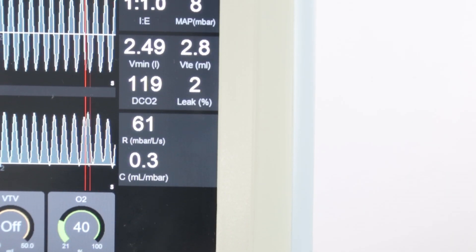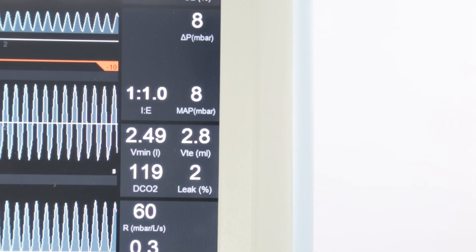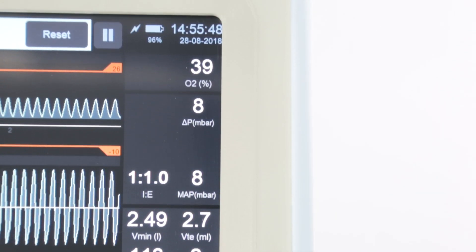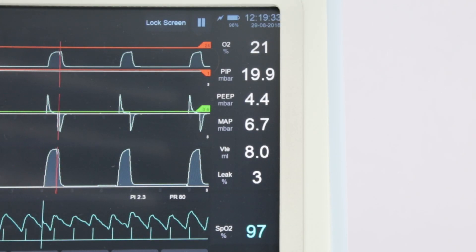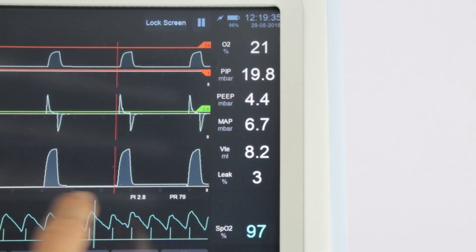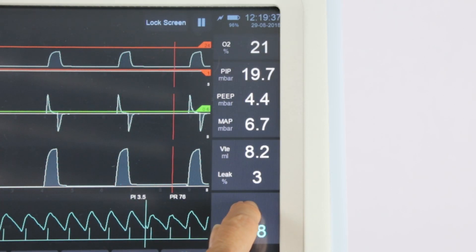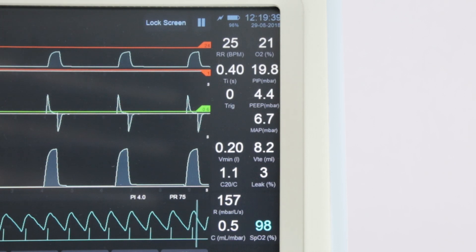The digital data panel is positioned down the right-hand side of the screen. Depending upon how your ventilator has been set up, it may show a single column or two columns of numbers. To switch between the two, press and hold the panel for one second. The second column of numbers introduces additional data when required.